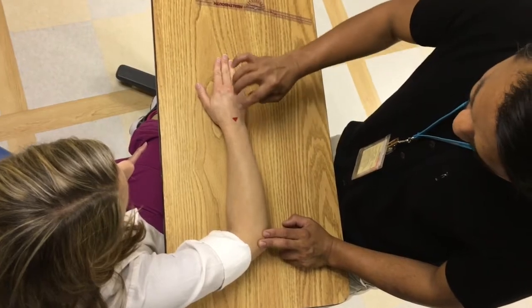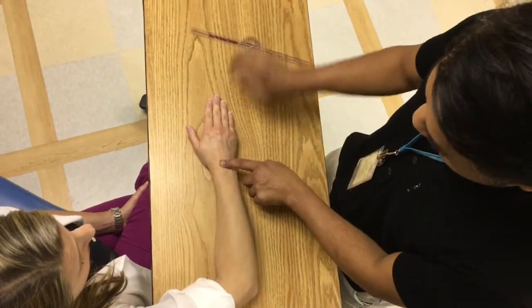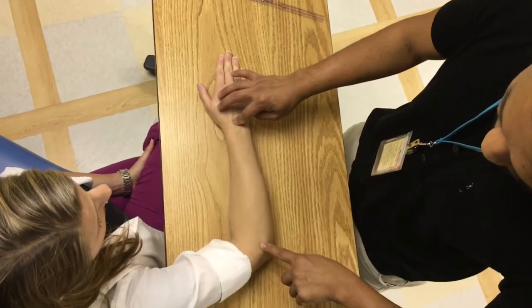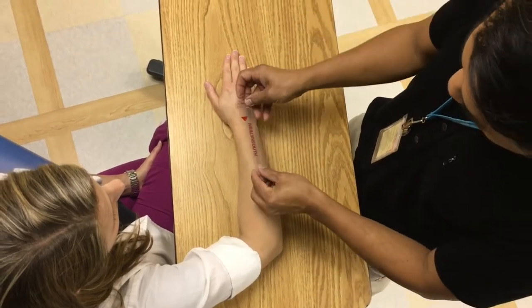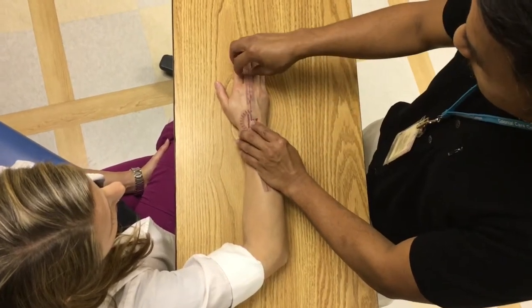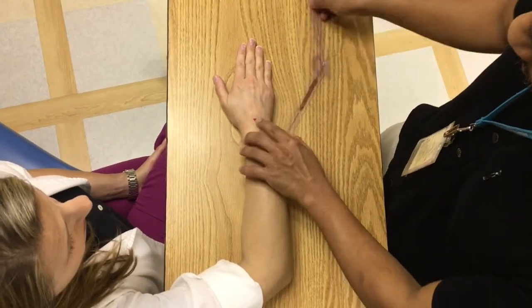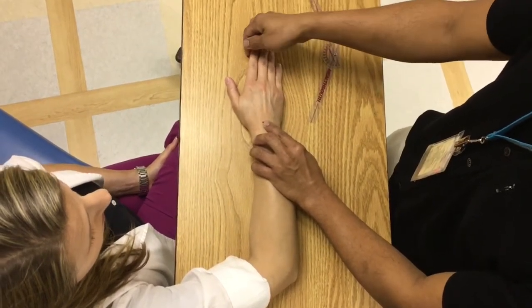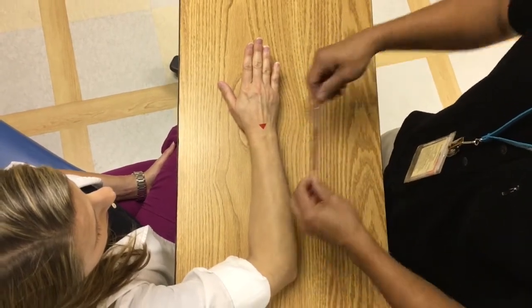Previously, I located her capitate, which will become our axis, and then our proximal arm, the non-moving arm, will be located on her lateral epicondyle. So this is the lateral epicondyle. The non-moving arm would go like this, and the moving arm would be based on the movement of the middle metacarpal, which is her third one, the middle one. Can you extend your wrist, Stephanie? There you go. See it right there. See the wrinkles?